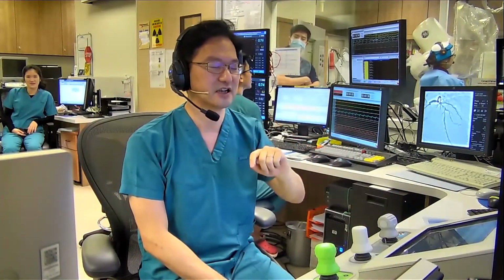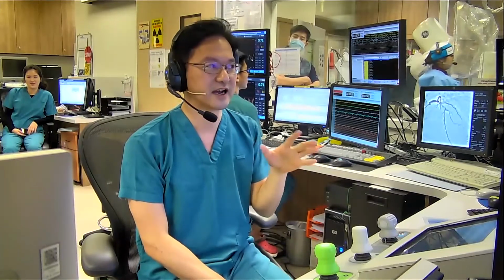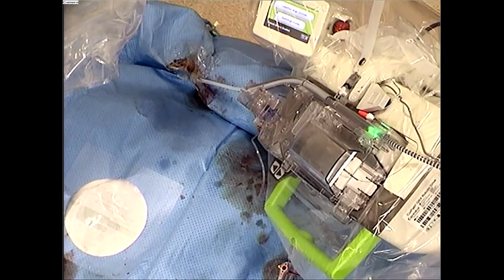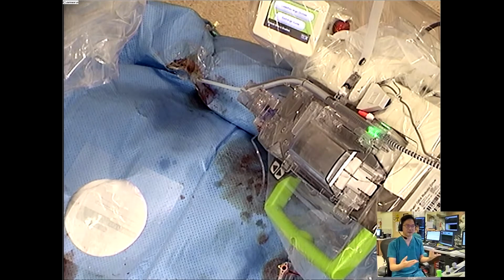So what I'm showing you now is the robotic arm connected to the guiding catheter. In this case, it is an XB3 guiding catheter gone in from the left radial approach. Okay, so one of the advantages of robotic, of course, is the operator doesn't have to lean across the patient. So left radial is just as comfortable, if not even better, than the right radial, because the setup is slightly out of the way. So you can also see the console in front of me.